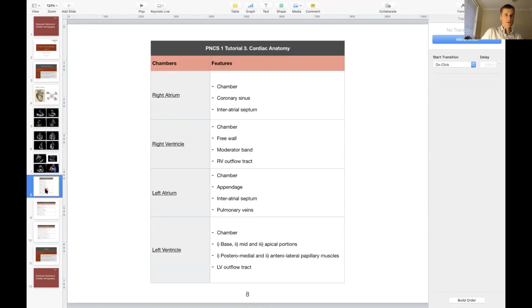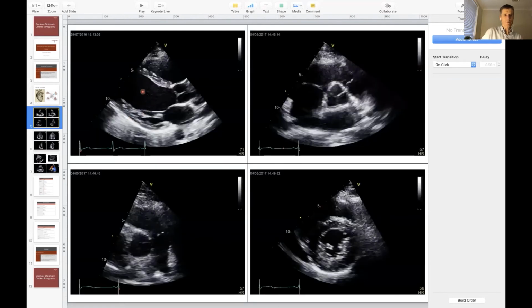We wanted to see things about the left ventricle. Okay, so we want to see the chamber, the left ventricular chamber. We want to see the interventricular septum. We want to see the posterior wall of the left ventricle too. Of course, we can see the left ventricle beautifully here, the round left ventricle, and that's indicative of a very normal looking left ventricle. We can see papillary muscles, the lateral and medial papillary muscles in that particular view.